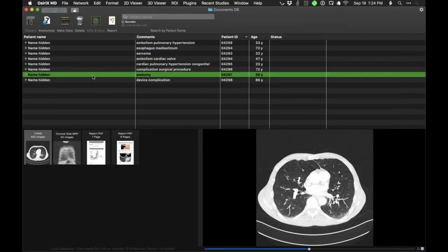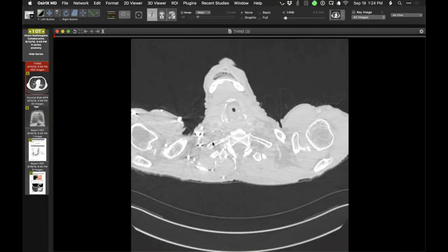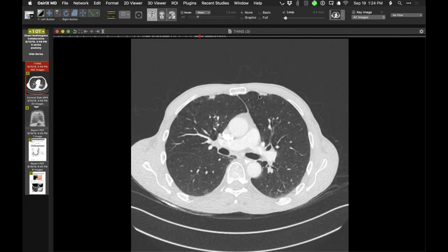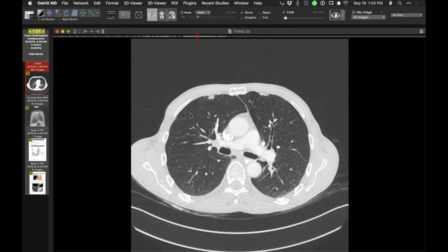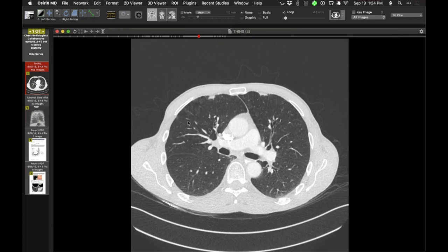Now this one is just a nice example, you'll see. We're reading out with a trainee, and the person correctly observed these small opacities in the anterior chest, near the pleural surface, and wondered what those were. They wondered if it was just some small foci of parenchymal scarring in the anterior portion of the lungs, but that's obviously rather unusual.